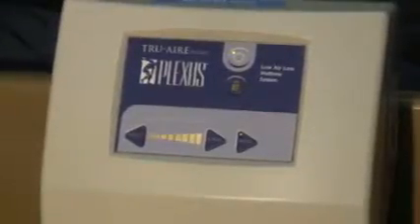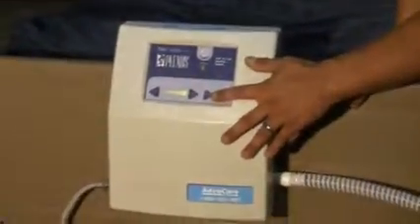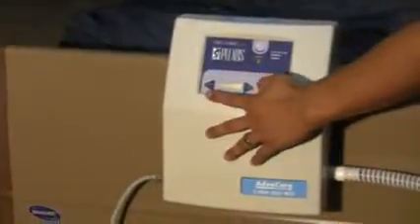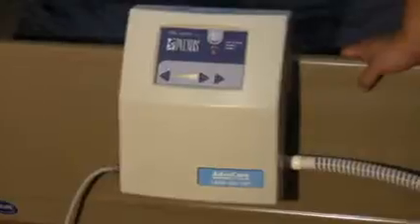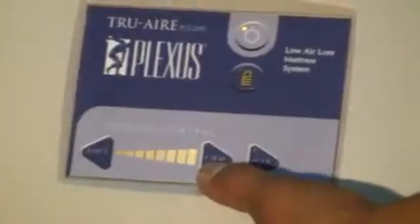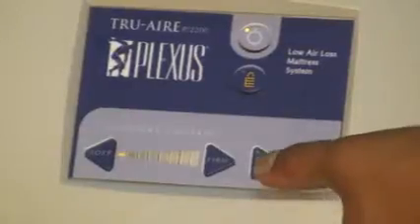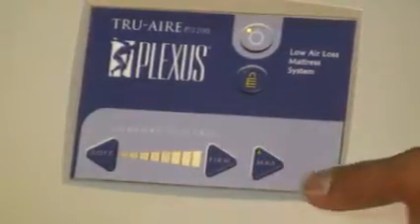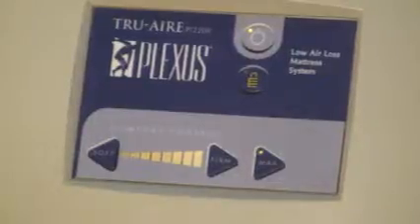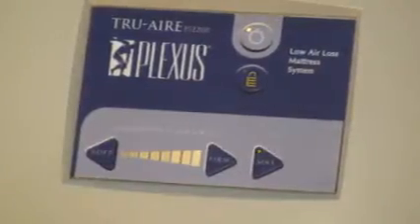Once you activate power to your Plexus 2200 air unit, you have a lock button, a max inflate, and soft and firm comfort control settings. The soft and firm comfort control settings allow for patient comfort to be adjusted easily, as well as max inflate is good for initial inflation of your low air loss overlay, as well as for patient egress and ingress when they get in and out of bed, because they would need a firmer surface in order to stand up from the low air loss overlay.